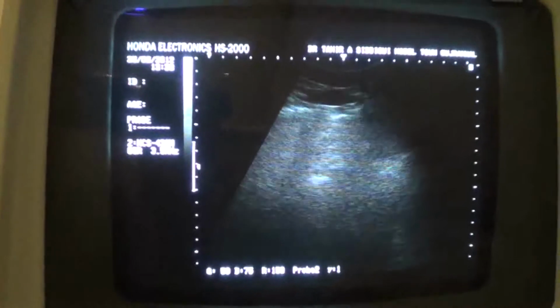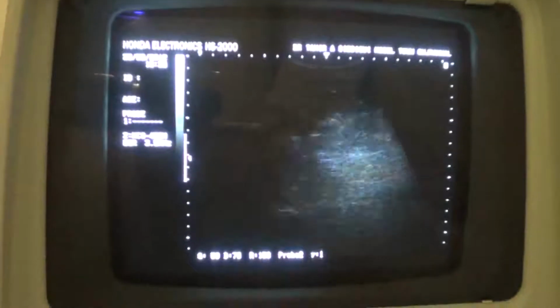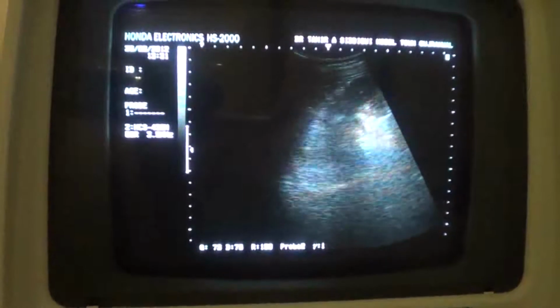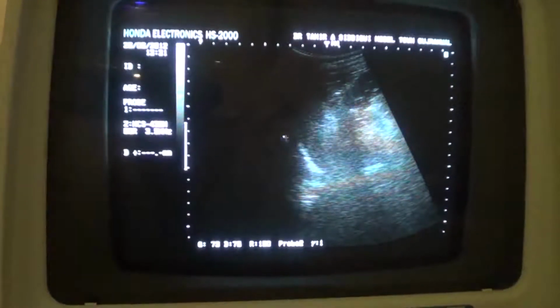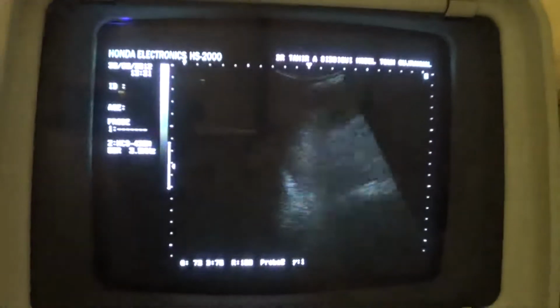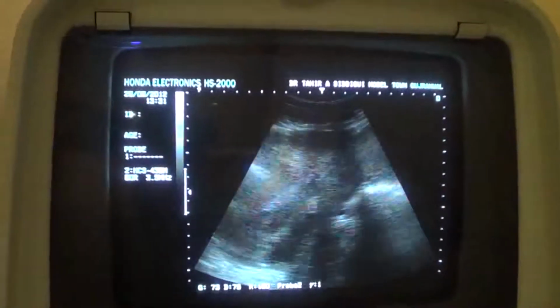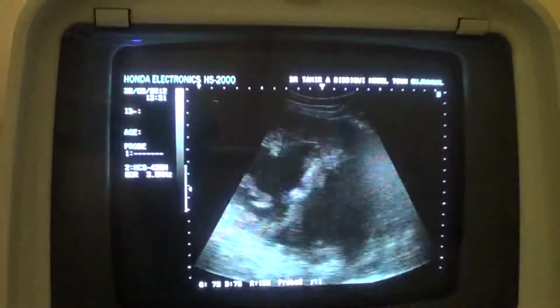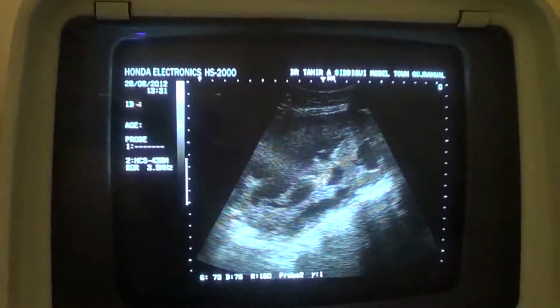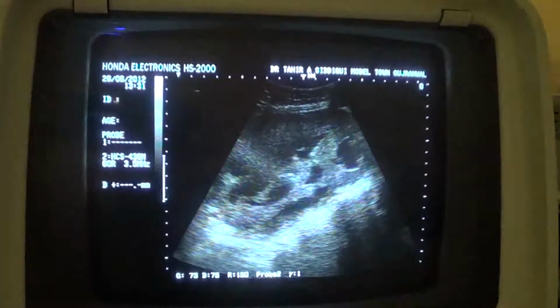This is the spleen. This is the left hemidiaphragm, part of the left hemidiaphragm, measuring 7.3, normal 7 to 12. So this is a case of ovarian cyst, a large ovarian cyst with bleed. These are in fact clots. These are clots within this large cystic area or bleed.